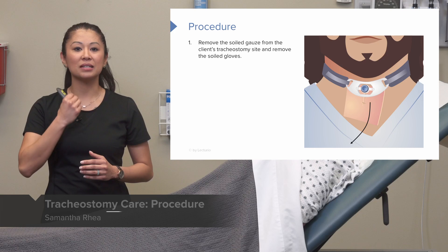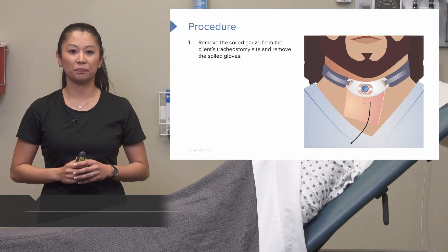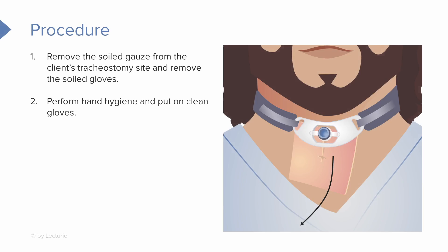We're going to take the soiled gauze that's around the patient's tracheostomy site and remove that first. We want to make sure we're careful about keeping that tracheostomy tube in place. Go ahead and perform hand hygiene and put on gloves.